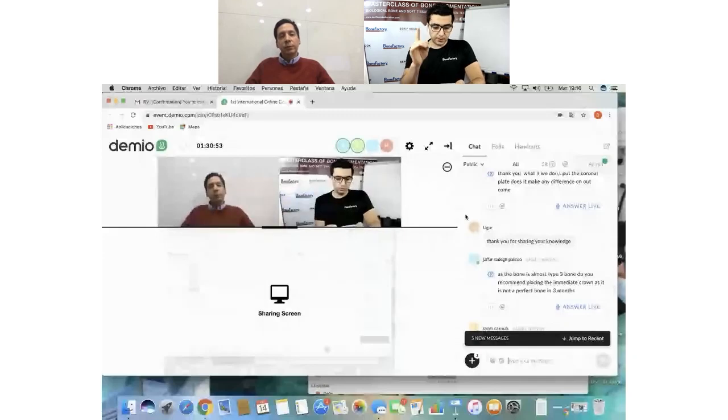Okay, the next question, from Lydia Tremeloda, thank you for the question from Facebook Live for the Biological Bone Masters Group. What did you use, microsaw or piezo tool? Both of them. I have both, and it depends. It doesn't matter to me. I have the microsaw and I have the piezo surgery. Whatever you have is good.